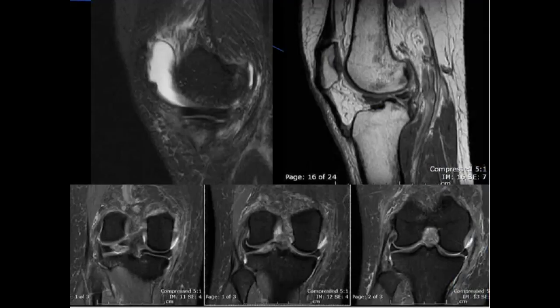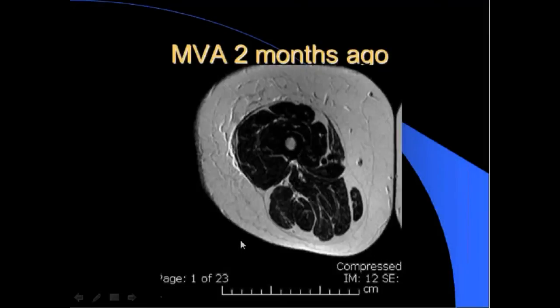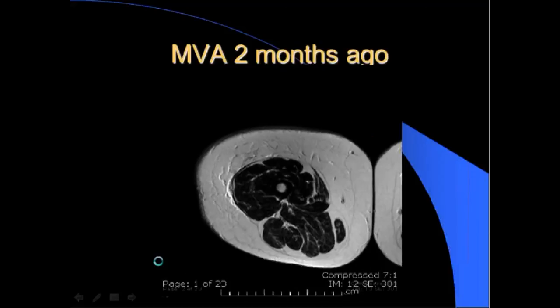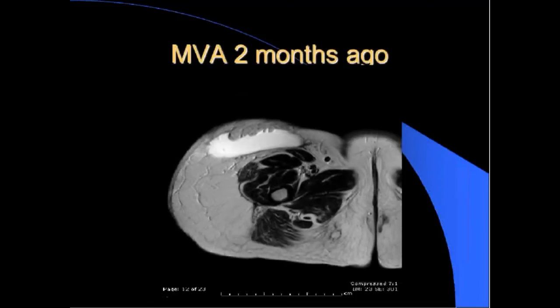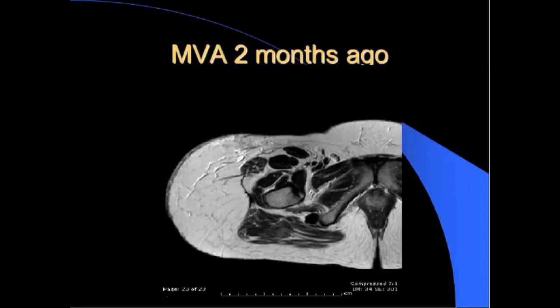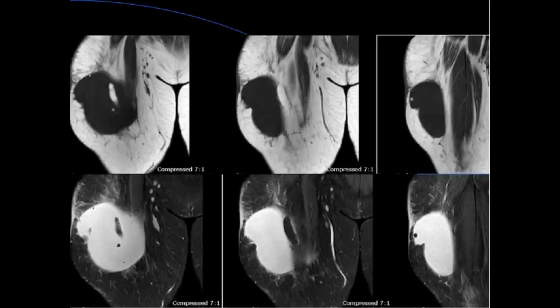Last case: MVA two months ago. This is an internal shear injury or internal degloving injury, which can appear as a mass acutely or as increasing swelling over several weeks.